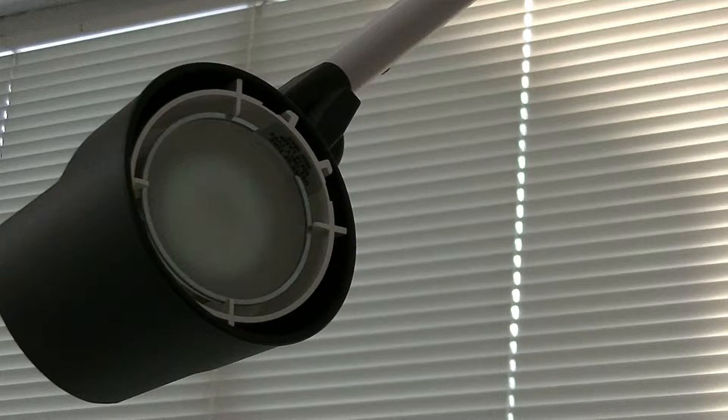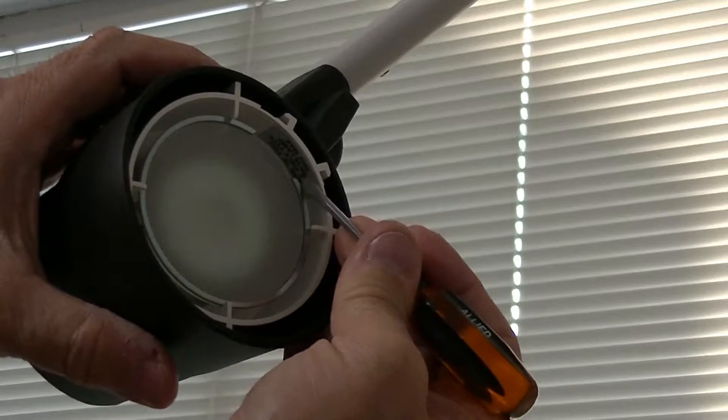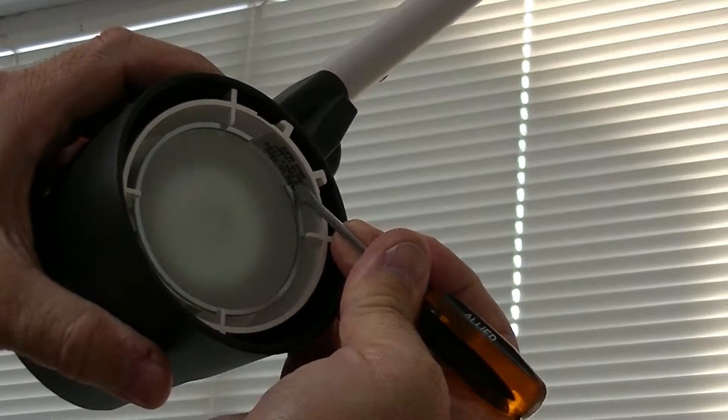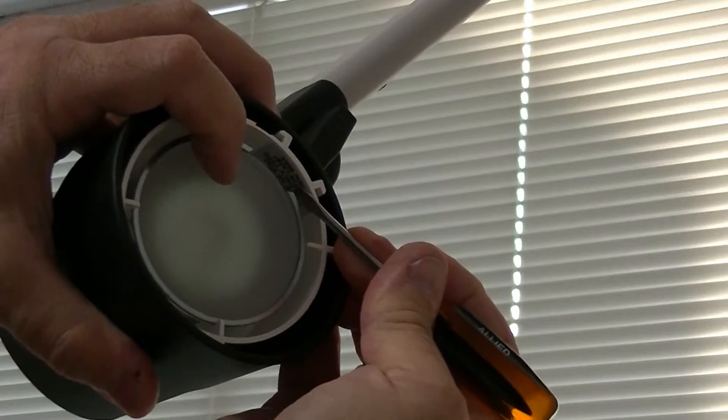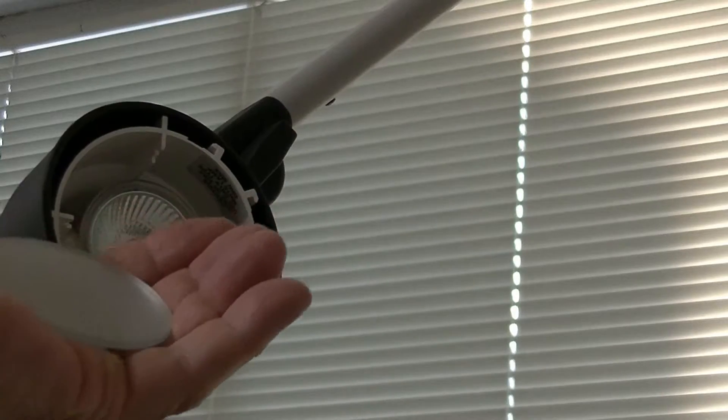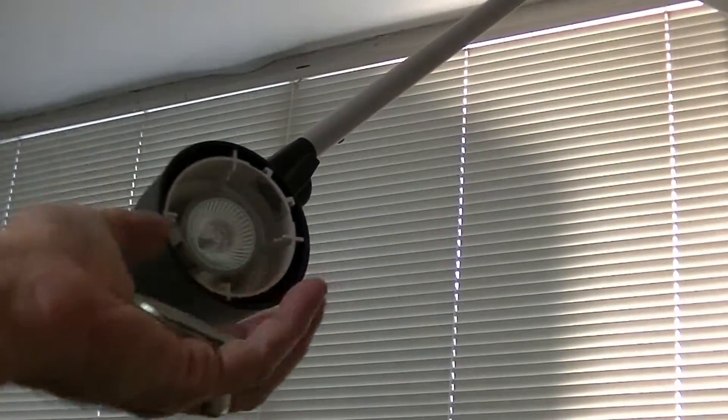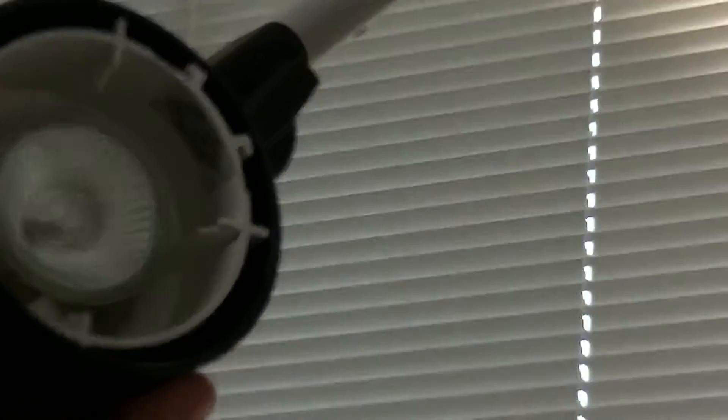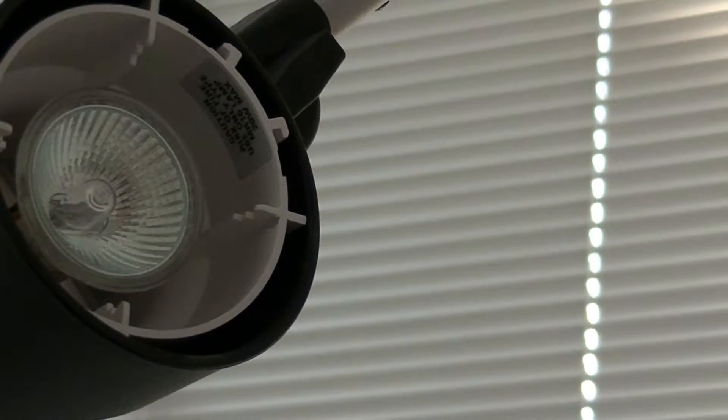So what you're going to do is you're going to take your screwdriver and you're going to push towards you and release this ring like that. And that ring will come out just like this. Put that aside.